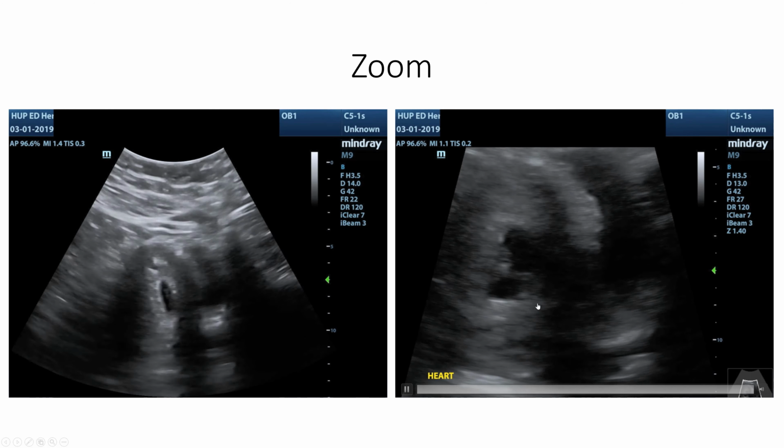And on screen left, it's just not possible with the limit in the resolution and the smaller amount of the screen that the object of interest is taking up. So for really tiny objects, maxing out the zoom can be the difference between a diagnostic scan that we're seeing on screen right here and a non-diagnostic scan that we're seeing on screen left that would require the patient to get a transvaginal ultrasound to come up with the answer that all we had to do is take 10 seconds to turn the zoom on and get the answer on screen right here.